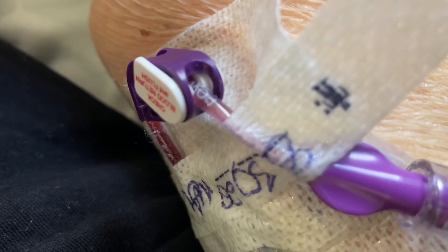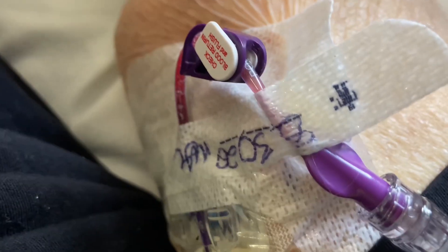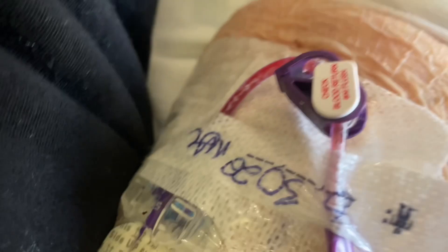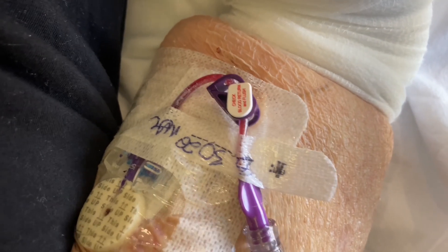As I'm doing that, you can already see the movement of the liquid going in and out and exchanging. You guys see that? Before there was absolutely no movement — now look, there's some movement. The TPA, the cath flow, is actually working now. There was zero movement in that catheter, and now even just with a couple seconds of cath flow, there's already movement.